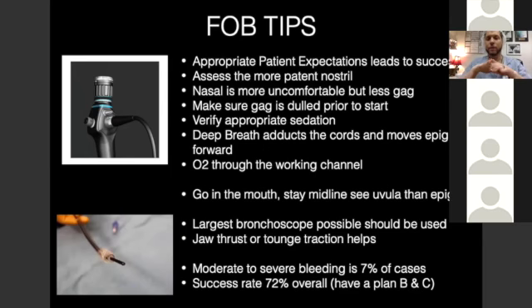A deep breath adducts the cords. So it moves the epiglottis forward. So when you're going in, when you see the cords, you spray them. Now, when you spray the cords, they're going to cough a little bit. Hopefully not too much because the remifentanil is running, but they're going to cough a little bit. And you may have to just wait a few seconds for that to settle down. But then before you go through the cords, you say, take a deep breath. And as they take a deep breath, the cords open up, and then you enter.